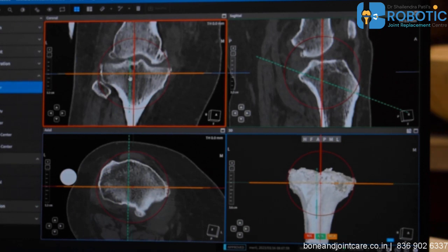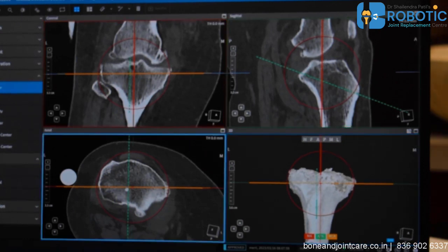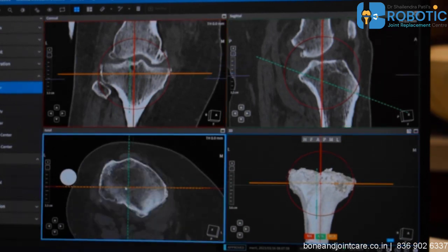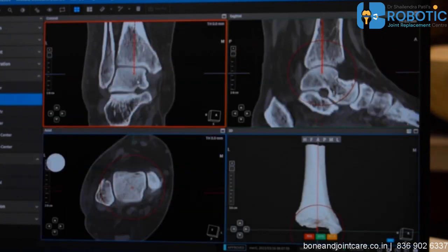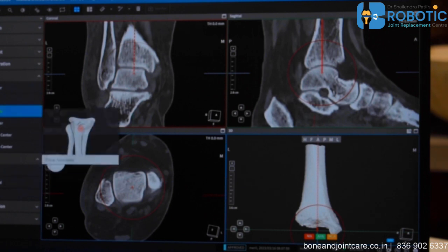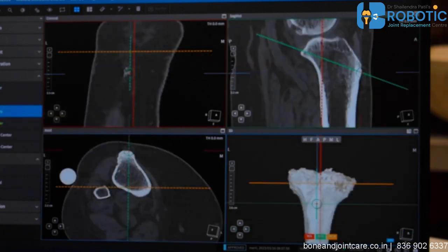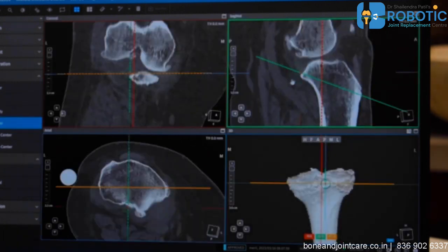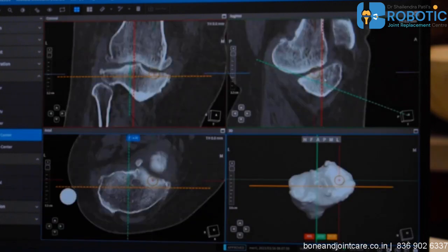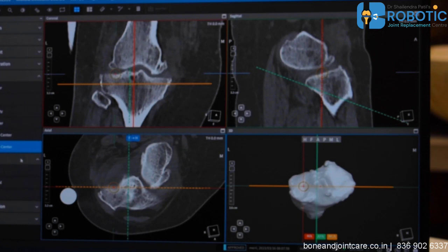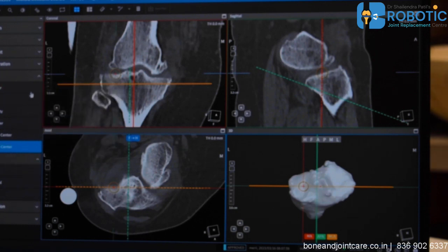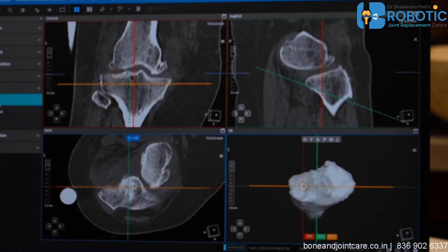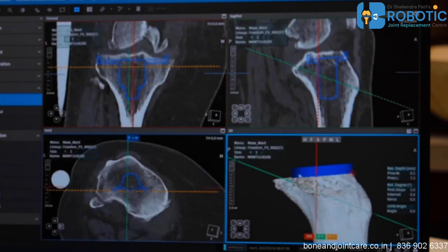For the tibial component, I register the center of the tibial bone — viewable in all four windows — the ankle joint center, the tibial tuberosity, the PCL fossa, the medial condylar center, and the lateral condylar center. When these six points are provided, the system gives me the appropriate implant size.